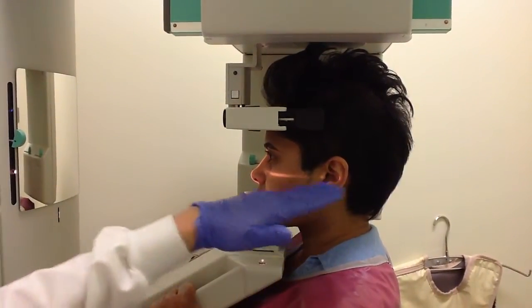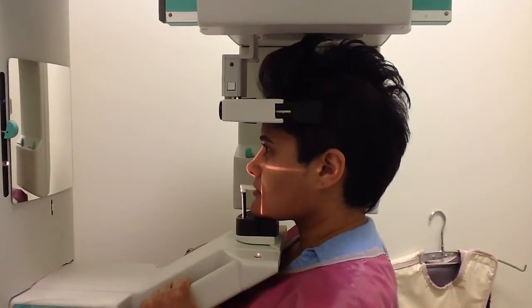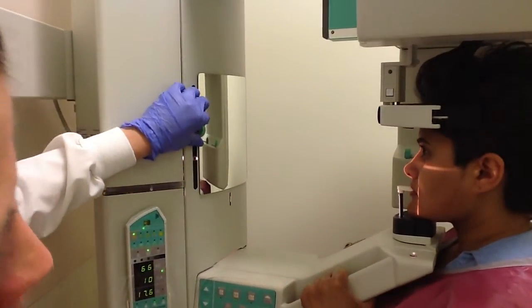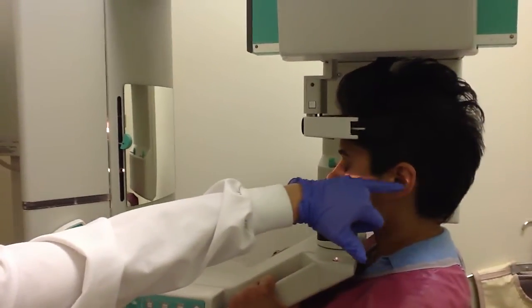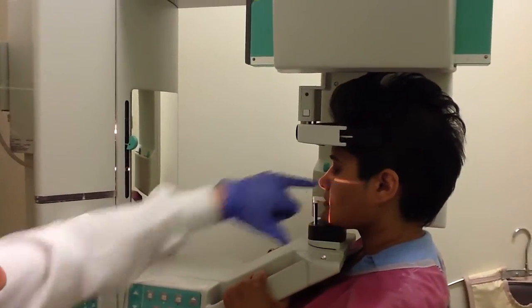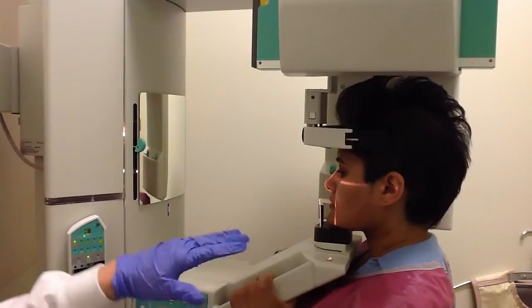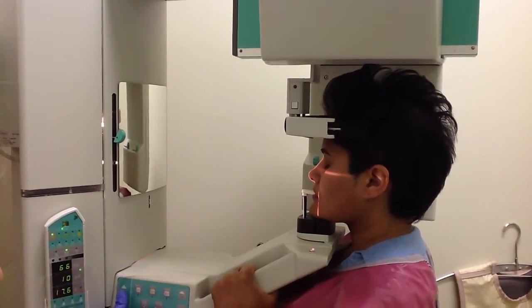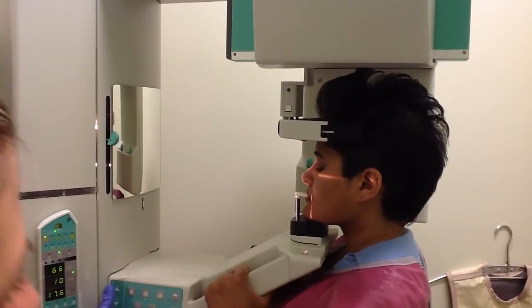The next line we're going to look at is the Frankfurt horizontal plane. We use this adjustment here to help us as a guide. We want it to be going right through the tragus of the ear and following the bone, the cheekbone there. And we want that to be parallel, lining up with our patient's Frankfurt horizontal line. So that looks good here for Fareen.